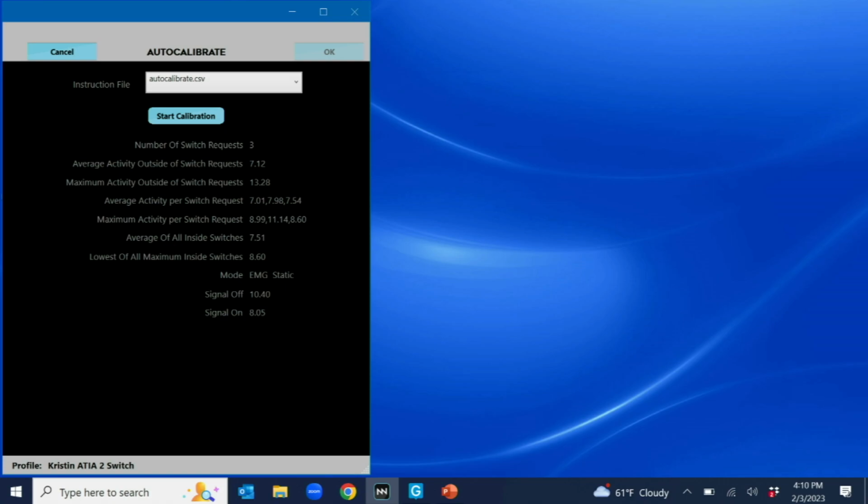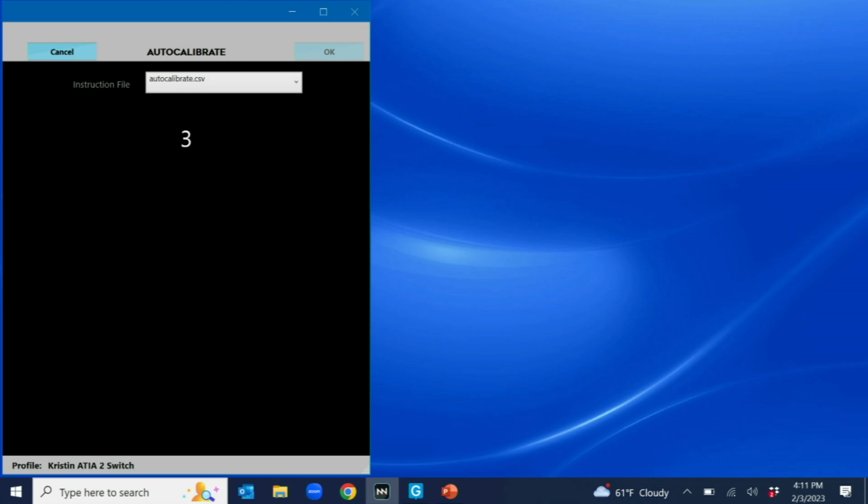And now we can just go back out here. Oop. Actually, it wants you to recalibrate. So each time it says activate, just do it one time. Oh, okay. Sometimes giving the right directions helps. Okay.